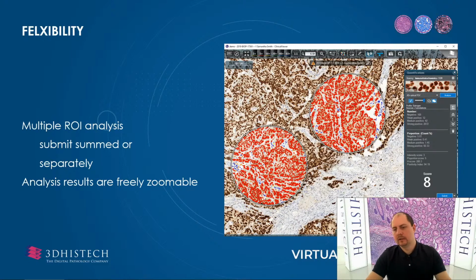sequentially, reviewed and committed. Leafing through the regions can be done with the buttons, with the double arrowheads pointing up and down, and the currently shown can be deleted by the paper bin button. The sum button combines the measurements as if all the regions were a connected area and analyzed in one step. The overlay mask generated can be freely zoomed for examination.